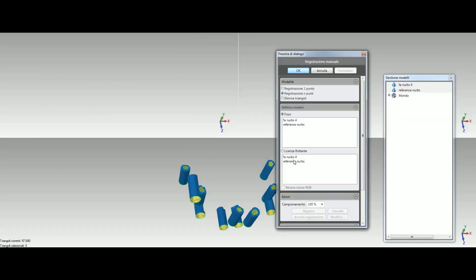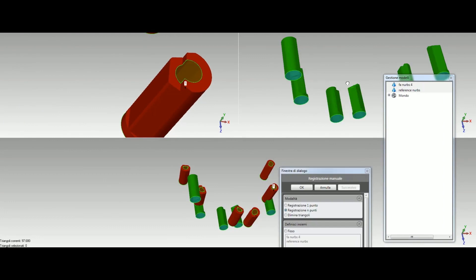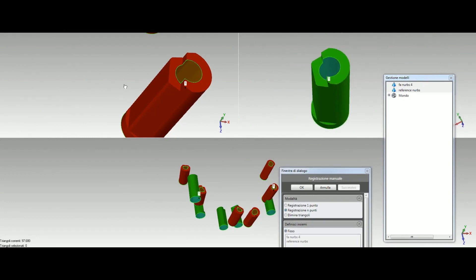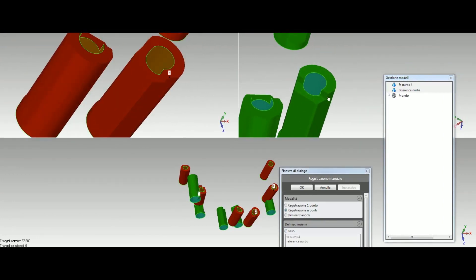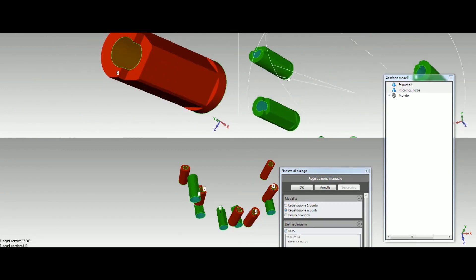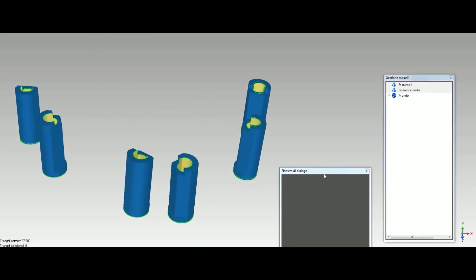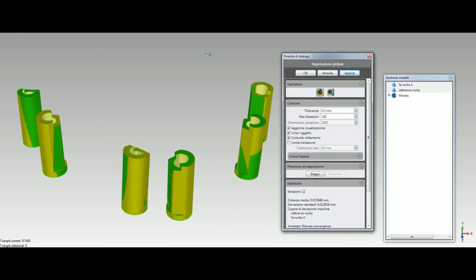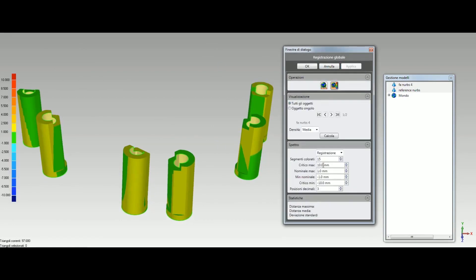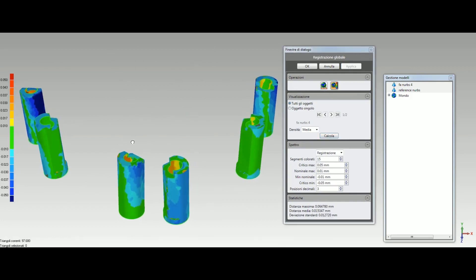For the NURBS-to-NURBS superimposition, we can see on the left the position of the library files derived from the reference acquisition with the desktop scanner, and on the right those derived from the intraoral scan — and then we superimpose them. Green indicates good results, while blue and light blue indicate deviations that are not good enough.